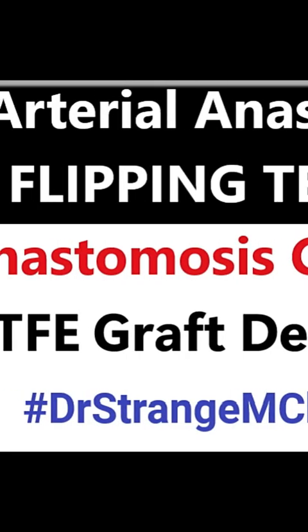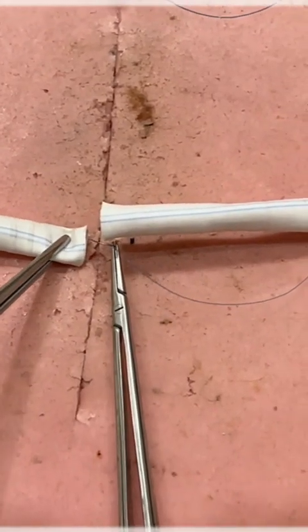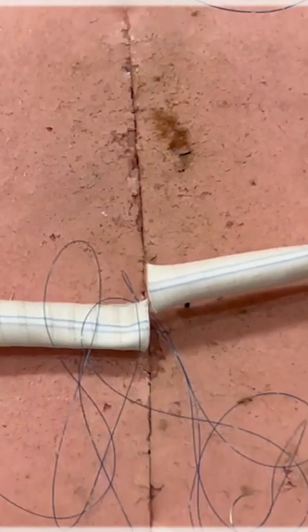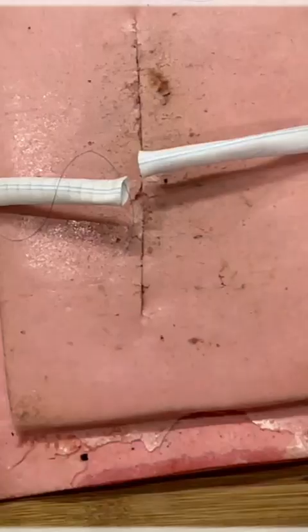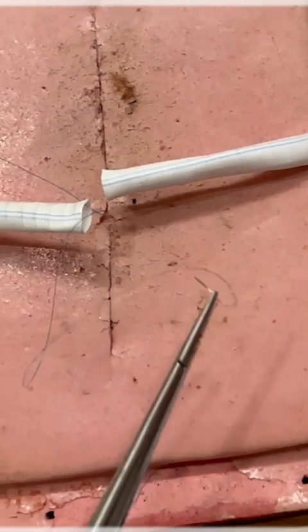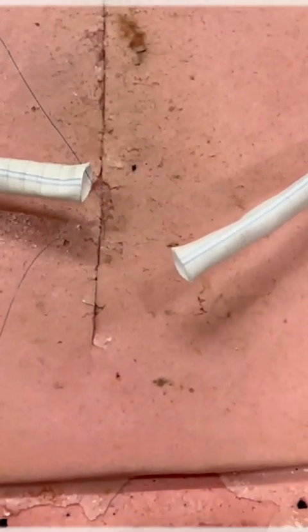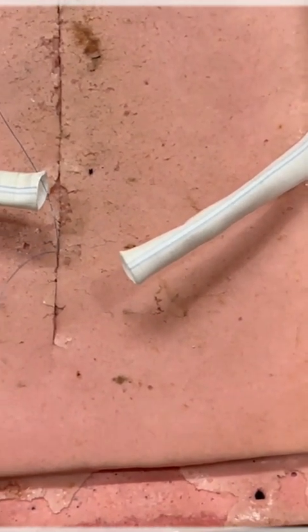So now let's see how to do it on a PTFE graft. The instrumentation and these details I've already covered. So we start with the suture at the farther end, that will be the 12 o'clock location. I take inside out on both sides, and as I have already discussed, keep the distance from the margin approximately 2 mm. Too much distance can lead to inversion, and too little can lead to cut through. So on both sides I come from inside out. So this will be the 6 o'clock suture. Always hold the adventitia, never hold the intima.